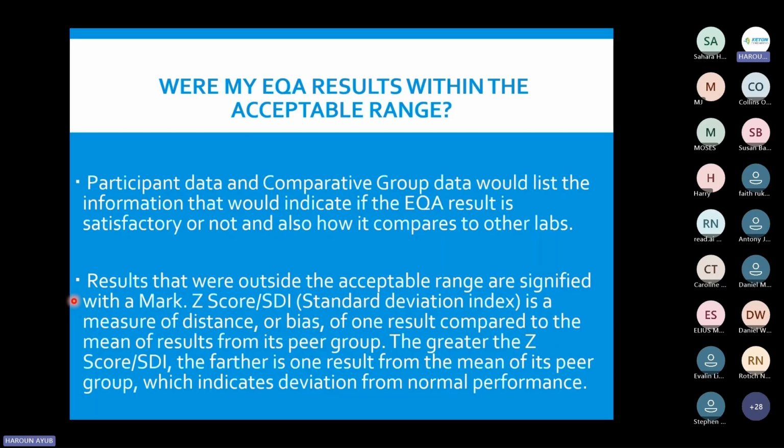Once you calculate your standard deviation, it will depend on whether you are having a relative deviation kind of impact. These are usually incorporated from the performance of that particular analyte or the allowable limits. So we'll be able to calculate your standard deviation. Now, the standard deviation index, which we also call z-score in our reports, is that deviation from the mean.